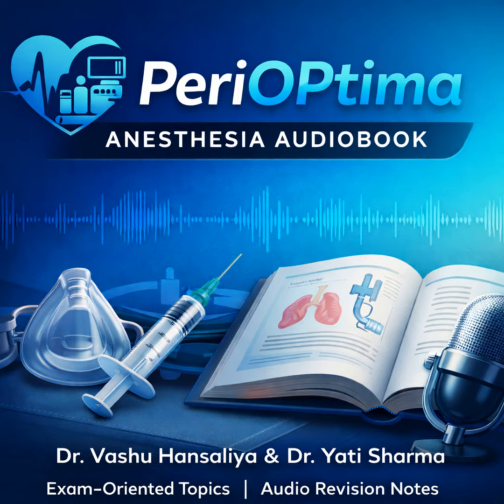And if that doesn't work? The definitive salvage is the wire-guided technique. You pass a guide wire through the FOB's working channel into the trachea, then you remove the FOB over the wire, and finally advance the ETT over that fixed guide wire. It turns a blind step into a controlled one.